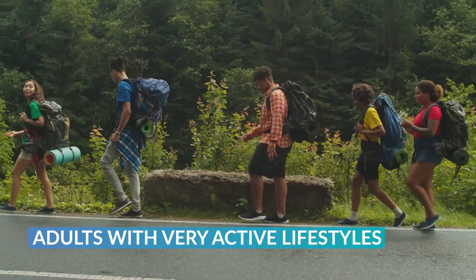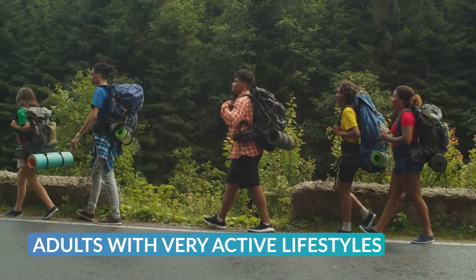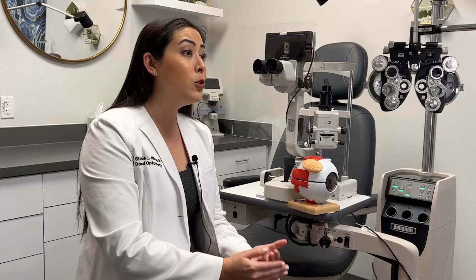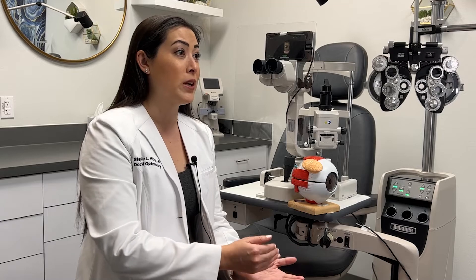Other uses that you may not have thought of are adults with very active lifestyles. We have patients that are very active — they're hiking, they're swimming, they're outdoors a lot — and they don't want to have to bother with normal glasses or contacts, so they will use orthokeratology so they don't have to worry about those during the day.